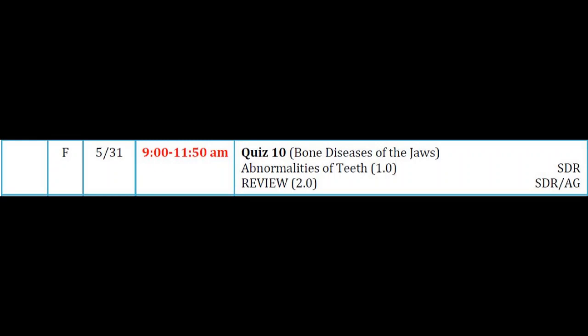All right. What about this patient? Cuspid, lateral, central, bigger central, lateral, cuspid, has the little groove in it, so that makes it gemination rather than macrodontia. So there are clues. Those may be a little hard. This one is radiographic, and you can see a really big wide tooth, two separate root canal chambers, and this patient got huge caries on that groove at the separation line, and so this is the decay. I don't have the clinical photo that goes with that. So sometimes you can see the twinning on radiographs.